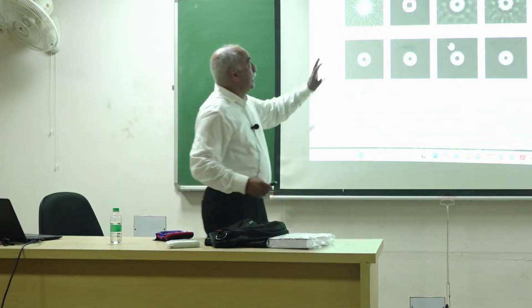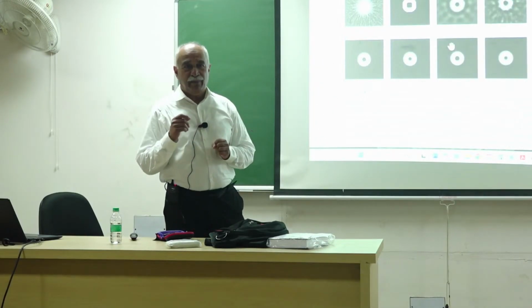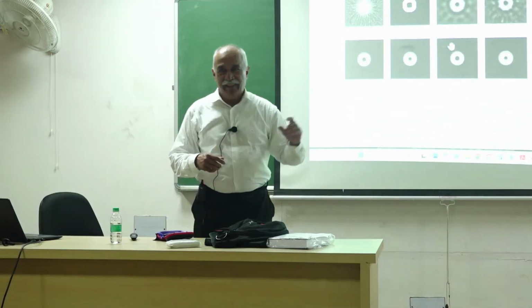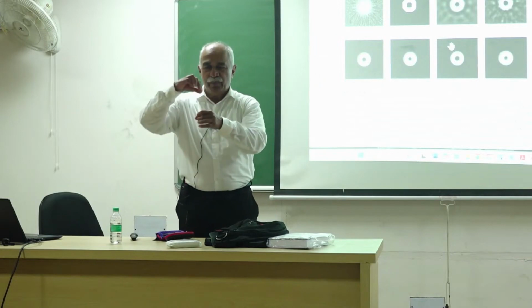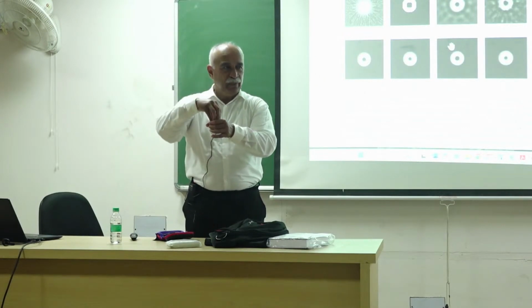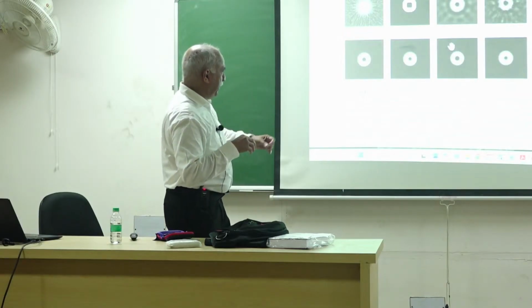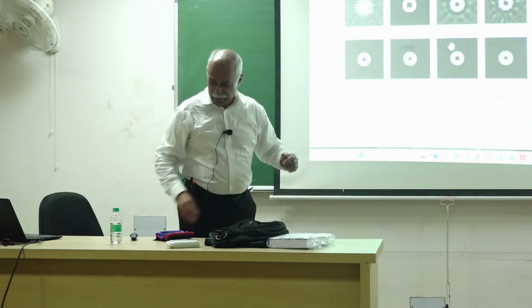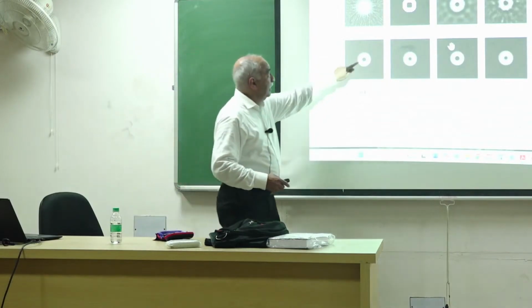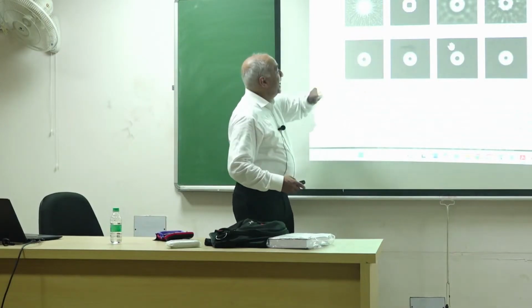But these are SPECT images, single photon emission computed tomography images, and this is of a phantom. I'll start with the phantom image. The phantom is a tube with a solid rod inserted, and the open space is filled with the radionuclide material. Thallium or technetium, it's not mentioned, it's in the book. So the cross section is like a donut, or a vada, with a hole there.